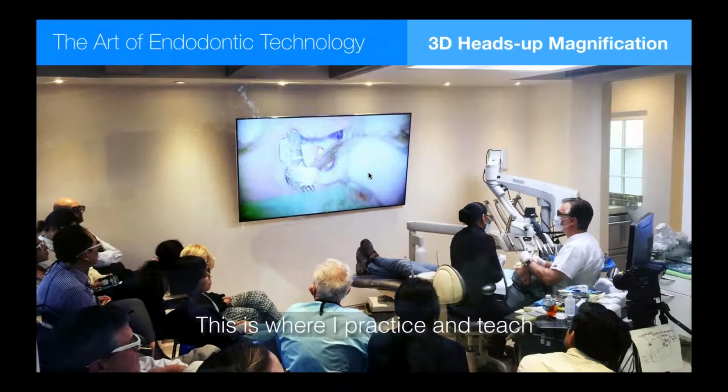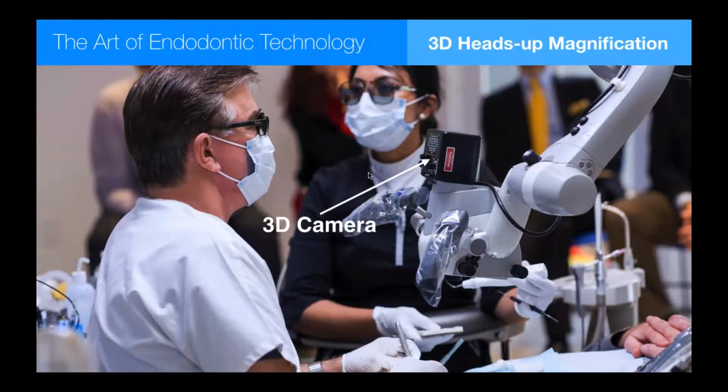It's a better position. I can make small movements in my body. My circulatory system is going to be much better served. And it's literally changed the whole physical experience I have of doing endo. I have more depth of field. I have unlimited positioning possibility of the microscope. I can put it over their chest, aim it up at their maxillary teeth, and cut an access cavity with no mirror in an upper tooth.